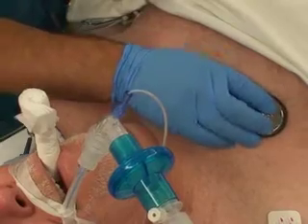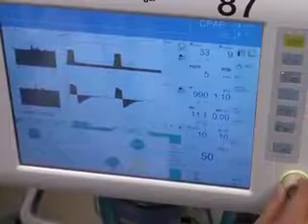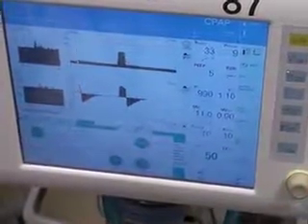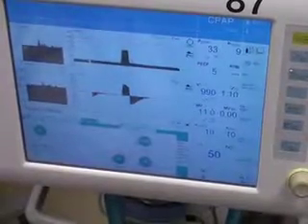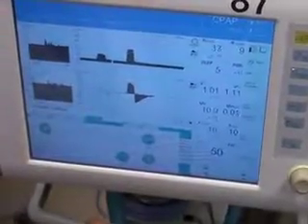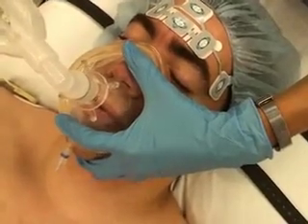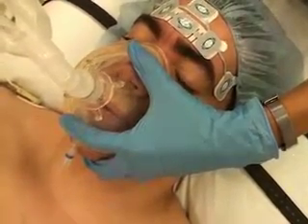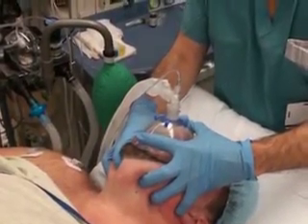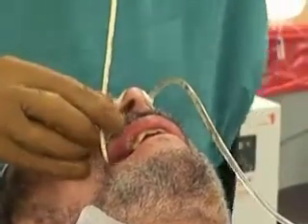In deciding whether to extubate the trachea, assess the patient's medical condition. Quantitative values such as respiratory rate, tidal volume, and oxygen saturation are useful indicators of extubation readiness, but you must consider all pertinent and available information. Ultimately, good clinical judgment is required. Be particularly cautious when the patient has high oxygenation and ventilatory requirements, when the patient has a history of airway obstruction, or when there has been previous difficulty in ventilating or intubating the patient.